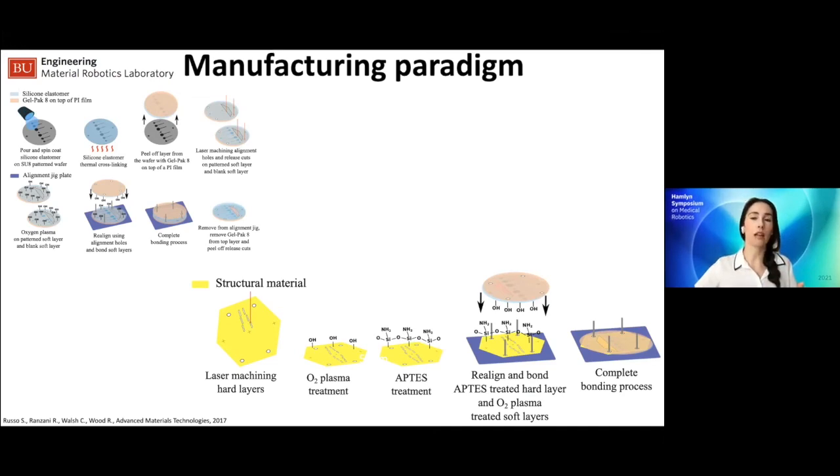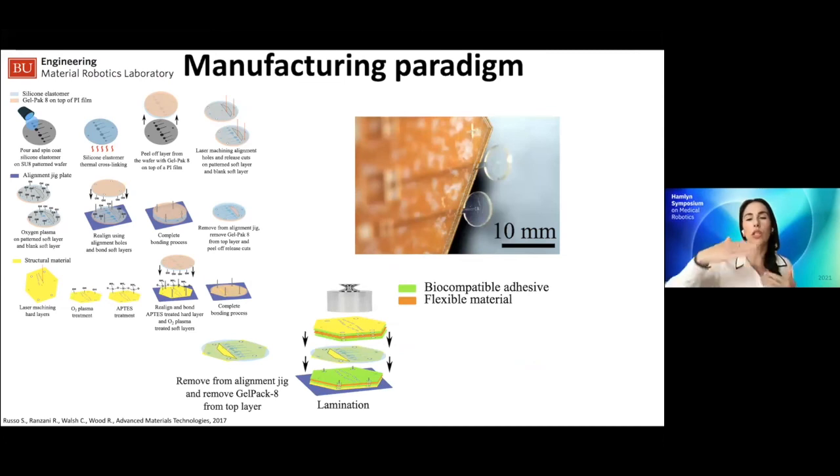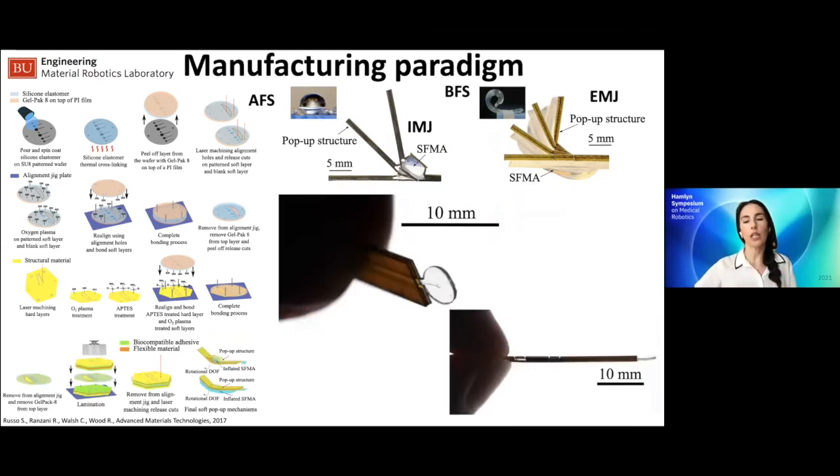We have focused on, once again, including into our manufacturing paradigm, biocompatible materials such that they can safely be used in surgical medical procedures. And so basically, our systems look like this, where you would bond a soft actuator here with a microchannel to provide fluidic actuation inside the actuator to a rigid substrate, which is in this case a fiber reinforced plastic. And then you continue sandwiching different layers of material depending on what kind of functions you want the robot to be able to achieve. And basically, at the end, you end up with soft foldable robotic actuators that look like this, and they are really thin, really can be miniaturized at really small sizes.